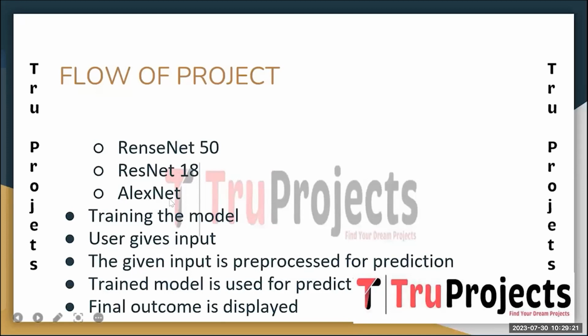And the next one is AlexNet. AlexNet is one of the pioneering deep learning models that gained popularity. It features a relatively shallow architecture compared to more modern models but was groundbreaking at the time of its introduction. In this project, we explore its applicability in neovascularization detection and investigate its performance compared to the more recent and deeper models.